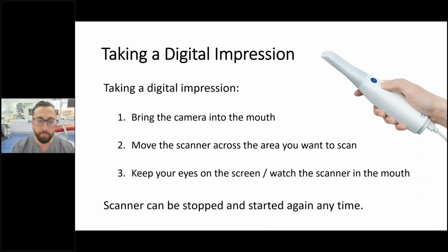Now, how do you take a digital impression? Frankly, these days, compared to what we went through when we first got a scanner, it's very simple. There's a lot of AI now in scanners that help to make the scan very simple, very easy to do. And you simply just put the scanner into the patient's mouth, start the scanner button, and then you move the scanner across the areas you want to scan. And in my opinion, the best way to scan is to keep your eye on the screen or the laptop. Rather than watching the mouth, you should be watching the screen itself to see what actual data you're capturing, because this enables you to stop the scanner if you need to and catch things early.